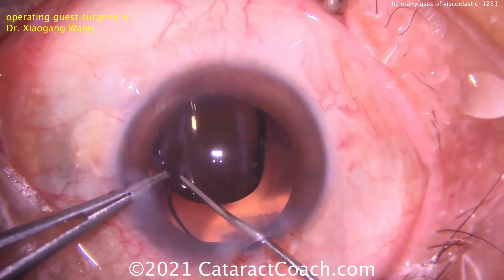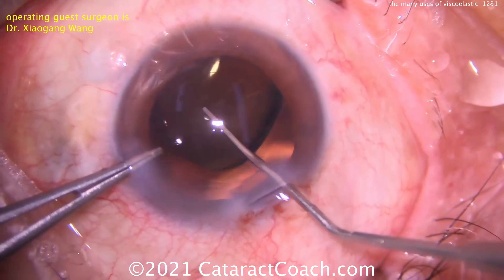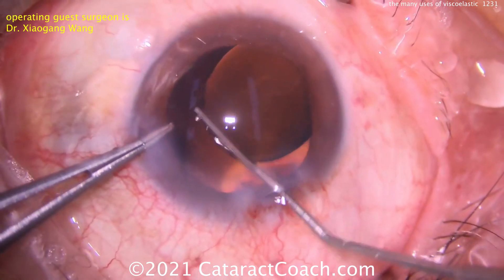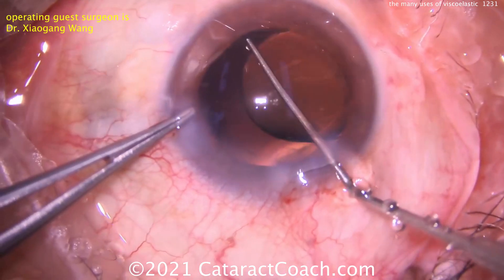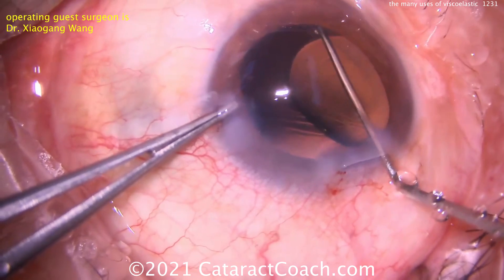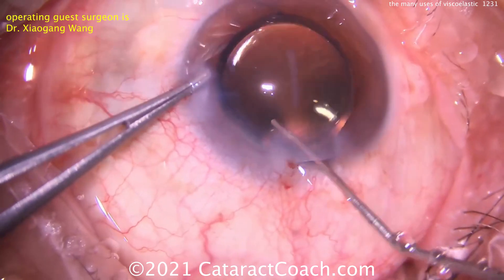Trying there — it's going in, but where's the haptic? I don't think it's in the capsule bag. Let's bring it around more. Is that trailing haptic going in the capsule bag? No. In fact, the AC is shallowing. The bag is shallowing because we've lost so much viscoelastic. You can still try to rotate it more, but now look — the haptic looks like it's coming above the iris.